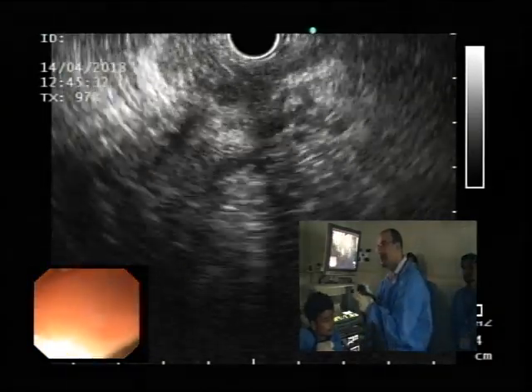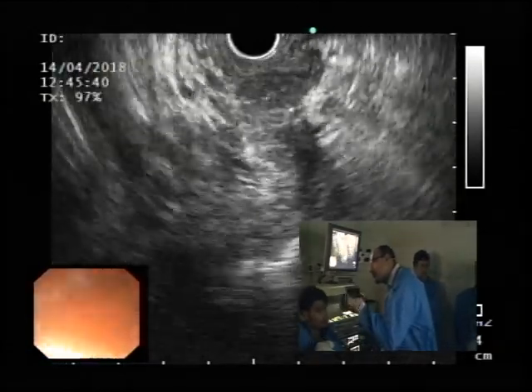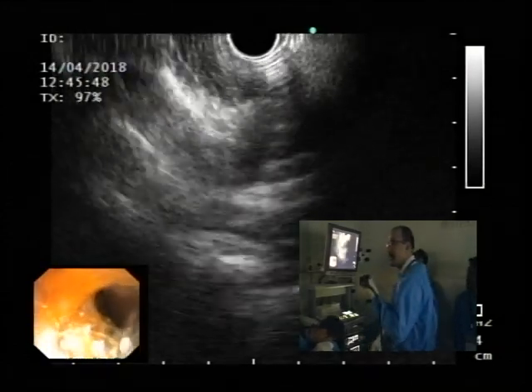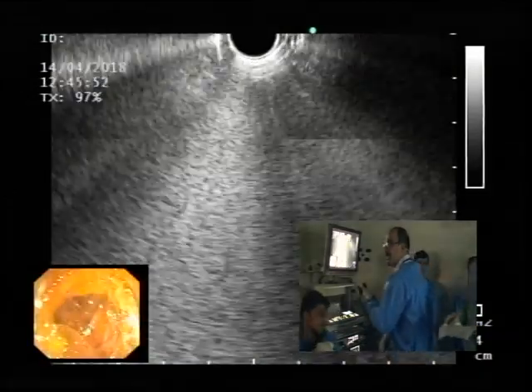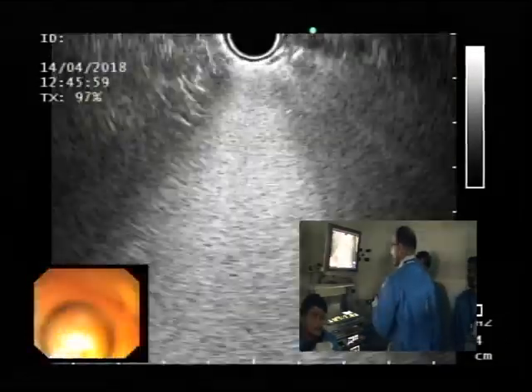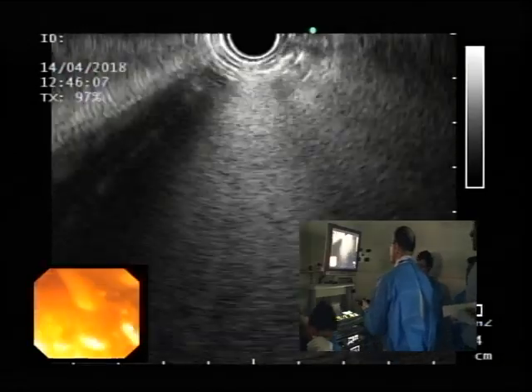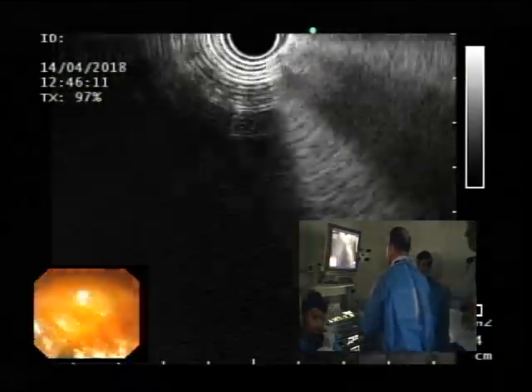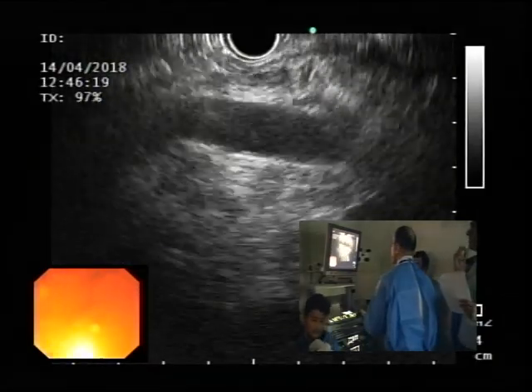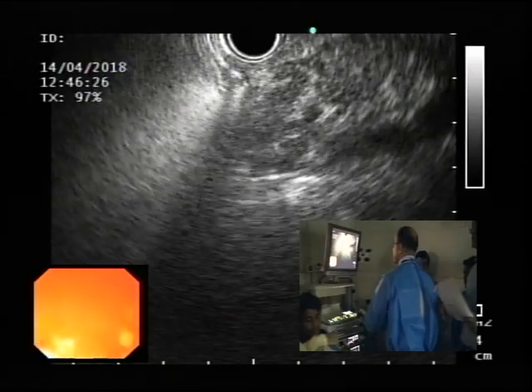Do we have an MRCP by any chance? I think there was an MRCP. We have a CT. Even on CT, the pancreatic duct was very dilated, now with atrophy of the pancreas. They suggested IPMN because of the appearance, and they thought there was a lot of mucinous content. But you did the minor, and your minor filled all the way to the body tail? My minor filled, you could see the whole pancreatic duct, except that it wasn't dilated. So there's a disconnect between this dilated pancreatic duct that you're seeing, and that we saw as well. And so the idea was to see if there have been any changes.